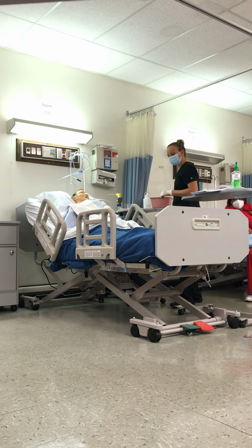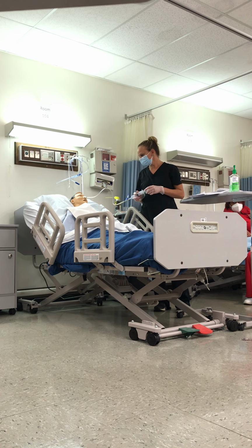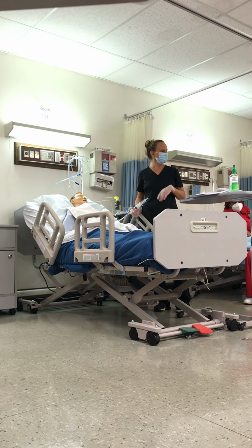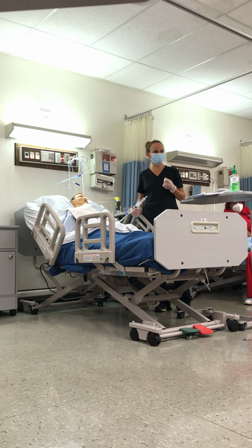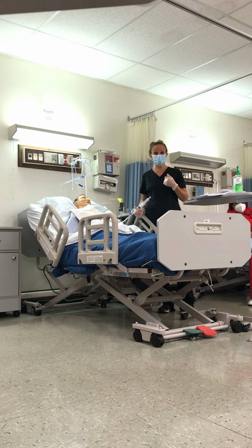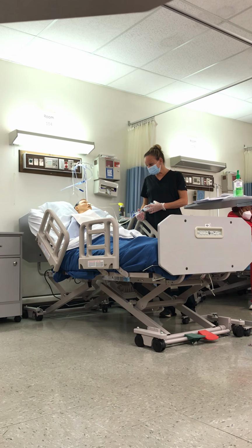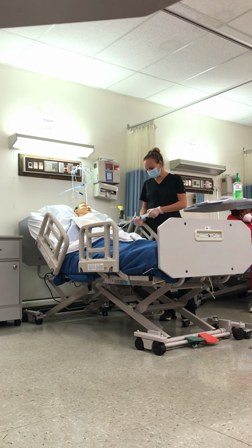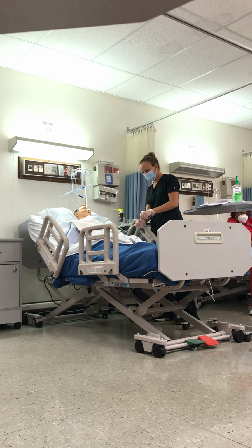So I'll check my placement. Personally, I guess it would depend on if they were going to go to suction or tube feeding, if that makes sense. If we're suctioning, I'd kind of just leave it where it was at, hook suction to it, okay? If I was tube feeding, we don't want to leave the contents in the tube, unless it's going to be hooked to suction, because we don't want it clogged up, right? So we're going to do tube feeding, so I'm going to push that back in there, okay? Now I can quickly remove that, place that.